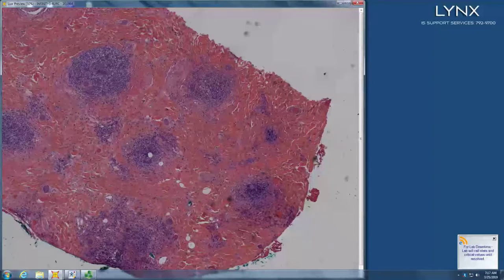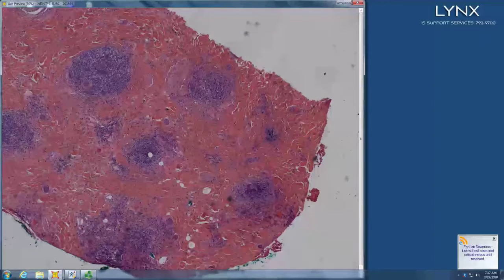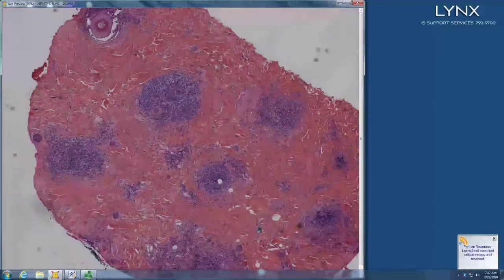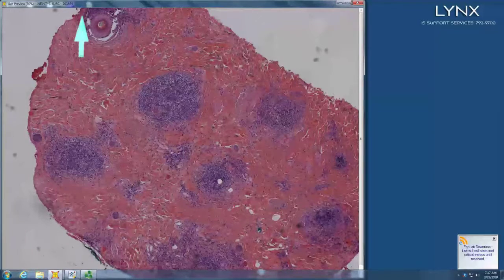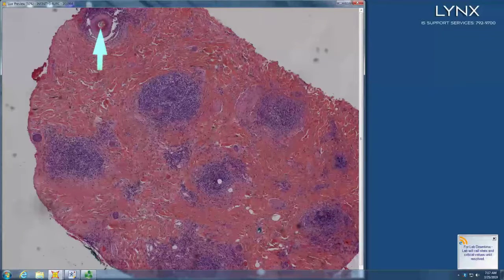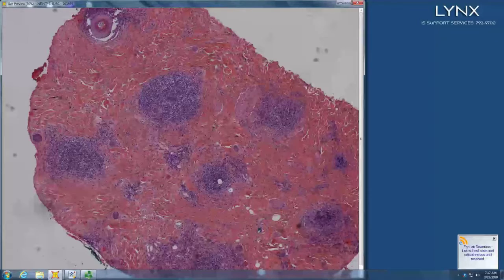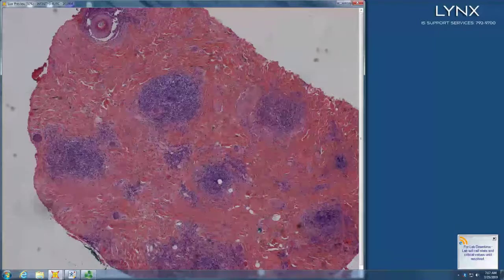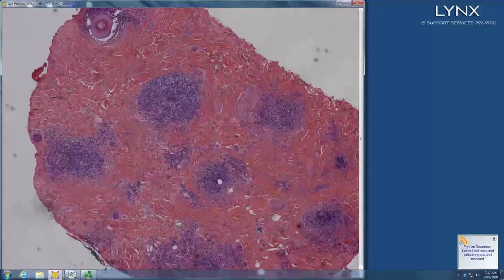Alopecia. Lymphocytes infiltrating around the follicle and the interstitial pattern. Yep, so interface pattern. Interface. And at what level, given that you still have a keratinized inner root sheath there? That puts you around the isthmus, right? Isthmus.